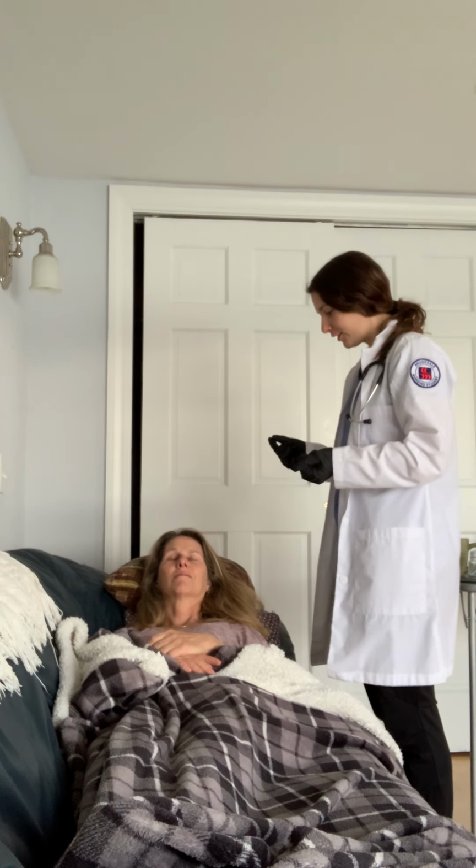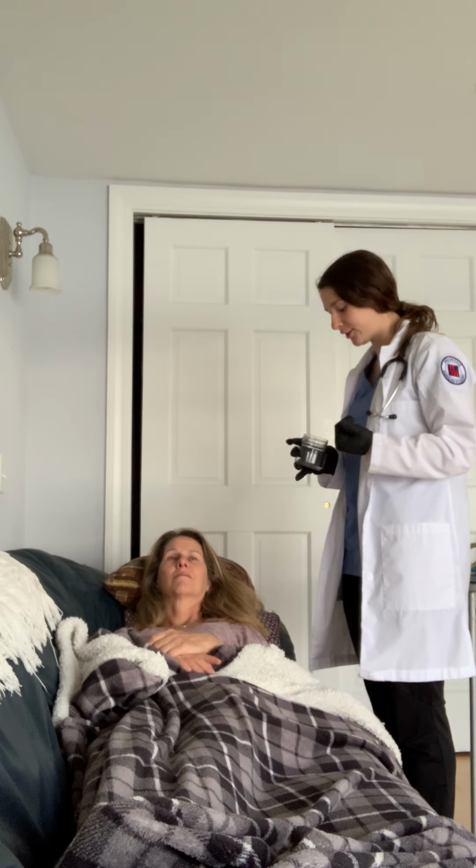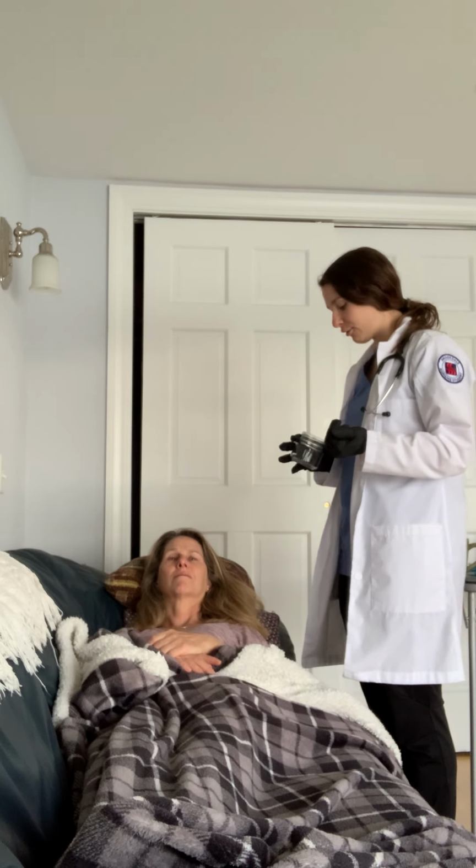So with the aspirate, what I want to do is look at the color. It should be like a green, sometimes curdled white consistency, which is residue from previous feeding. You don't want to have too much residue. That could indicate that the GI system isn't working as it should, but she didn't have too much. It was about 50 milliliters of residue, and it's a nice green color.